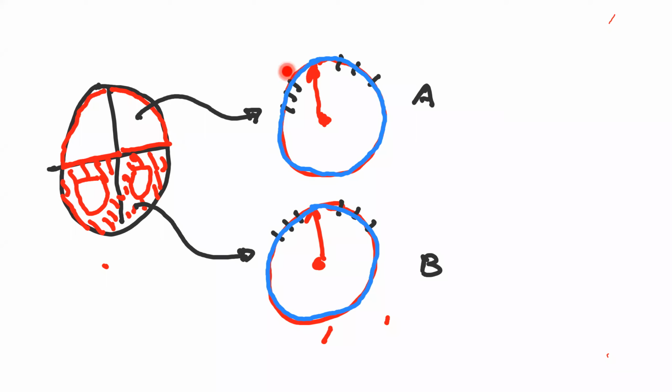Let's think about the magnet force is 10, right? Then the first thing is this needle fluctuates as 10 like way. Then ඔක්කොම depolarize වුණාට පස්සේ then it comes to the 0 point. Okay, come to 10 and after depolarization come to 0 point.